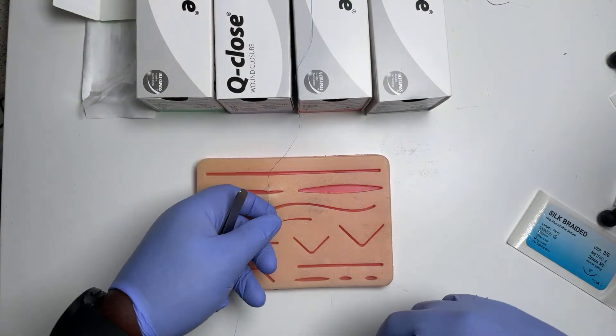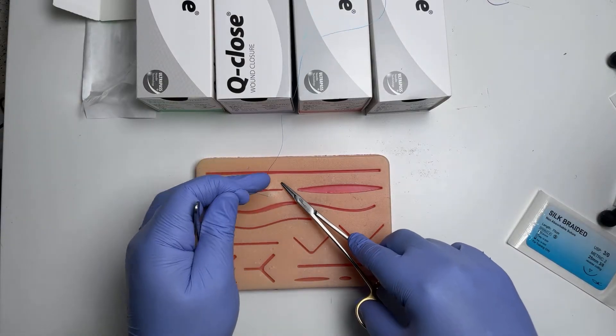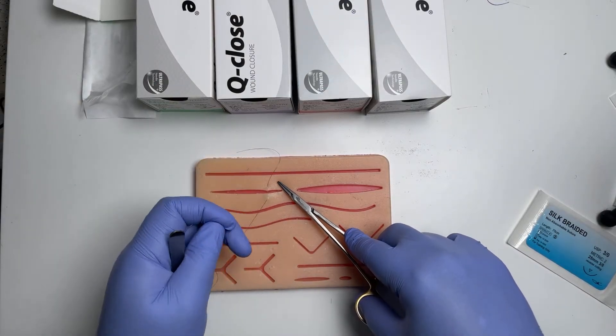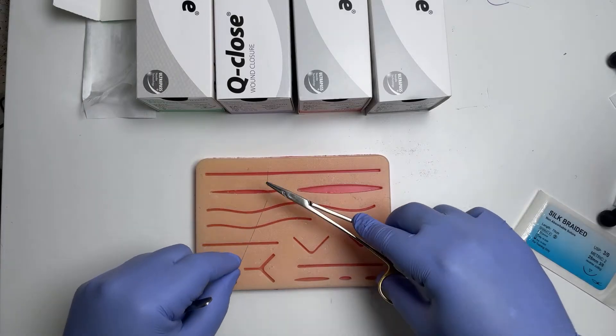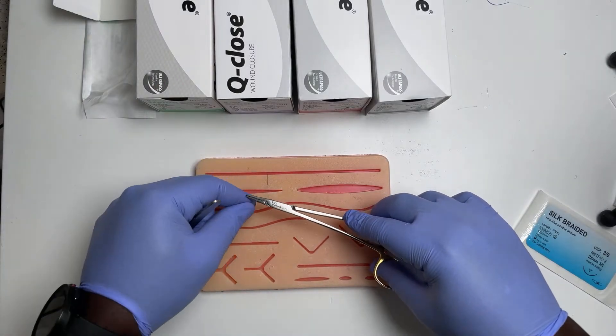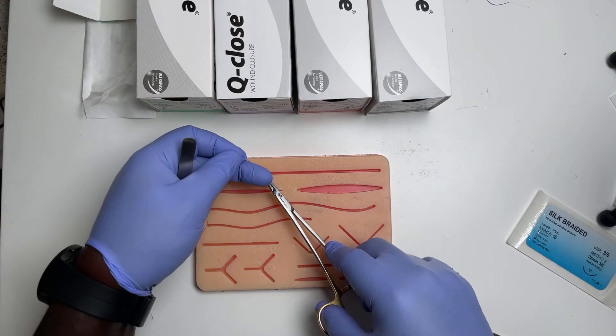Palm your forceps. With one hand, pull the suture like this and then rotate. One, two, grab the tip and tie.